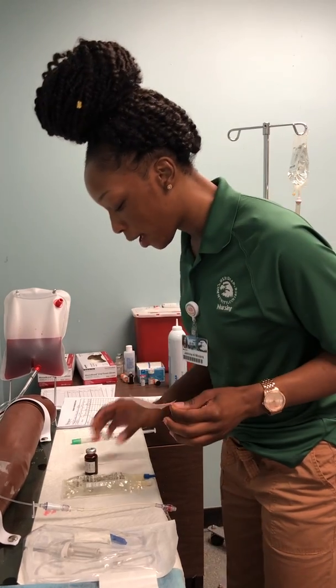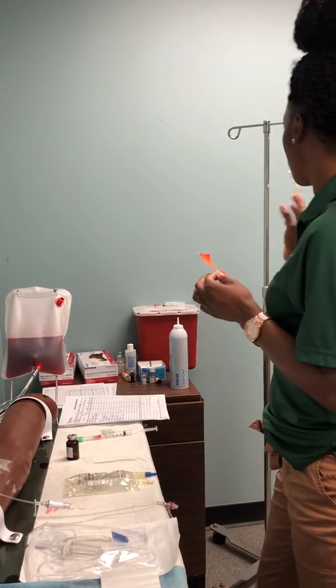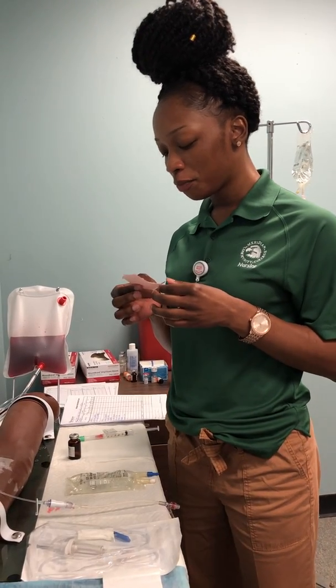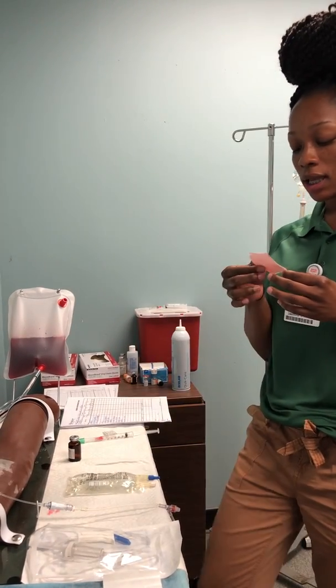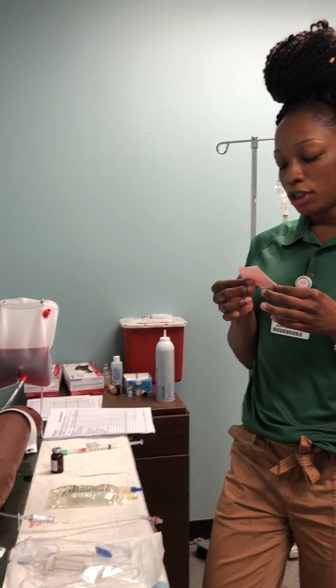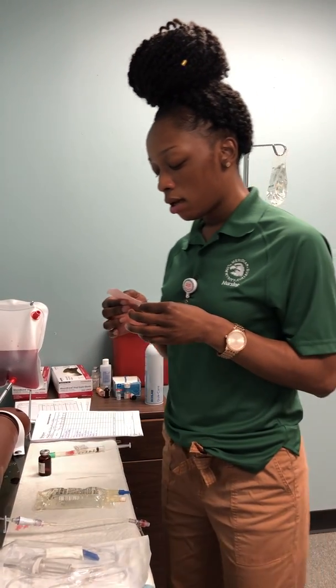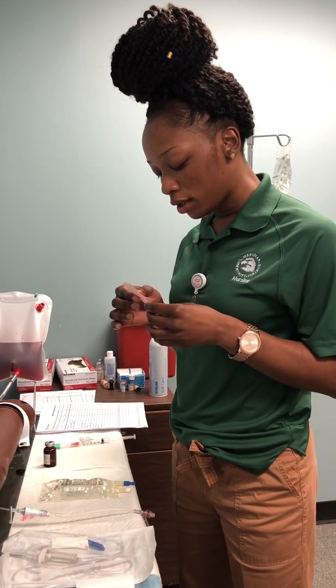Then I would label my gentamicin with the drug additive, which is D5W, which is compatible with the gentamicin and the Lasix. And my initials, the date, the time, expiration date, the patient's name, the room number, start time, start date, flow rate.